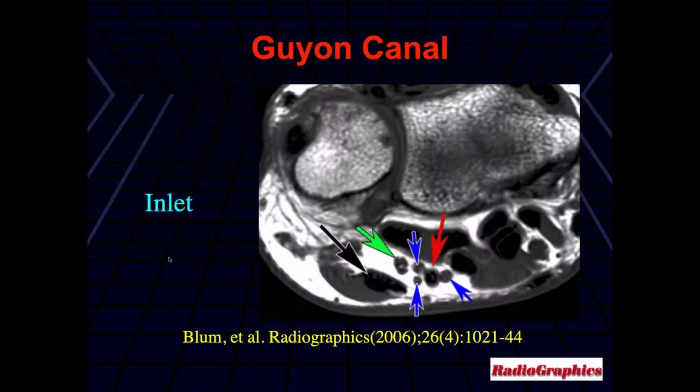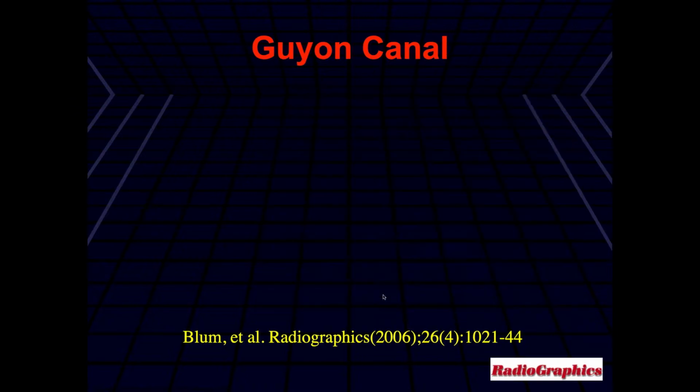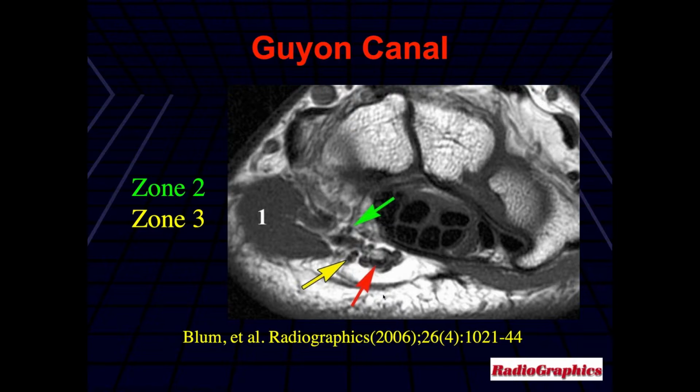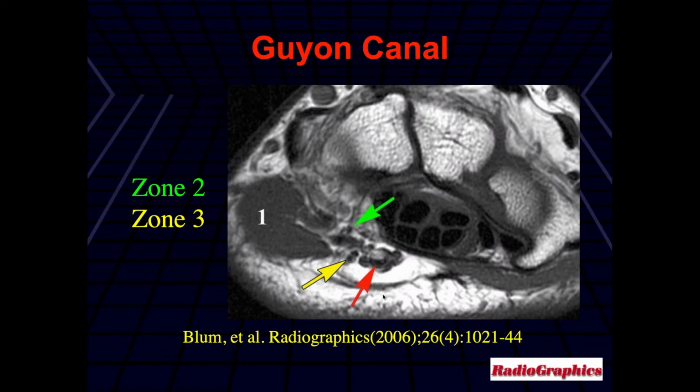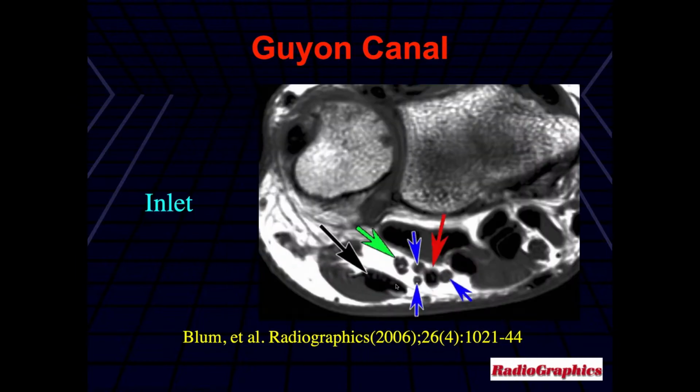Okay. Now, in this particular area, looking at further anatomy, there's Guyon's canal, which is on the ulnar aspect of the carpal tunnel area. Here's the flexor carpi ulnaris. Let's just go through these. Here's proximal, and what we're seeing here are artery, veins, and nerves. Here's the flexor carpi ulnaris tendon, and then this is fat surrounding it. This is the carpal tunnel over in this area.